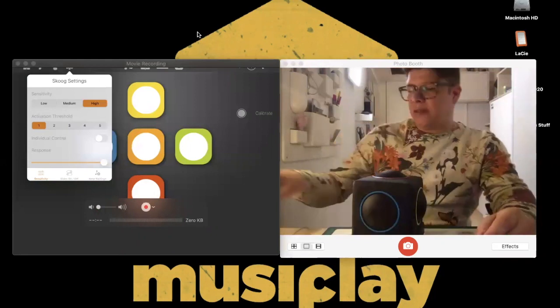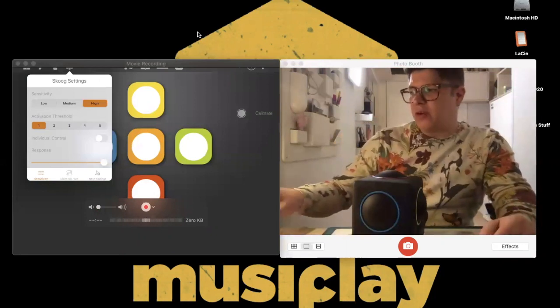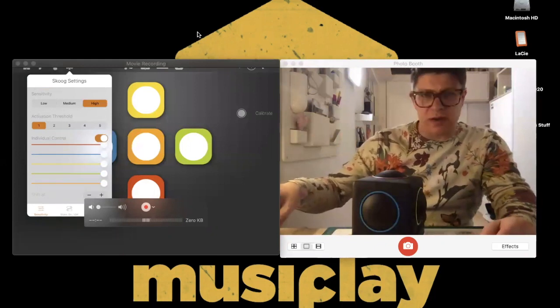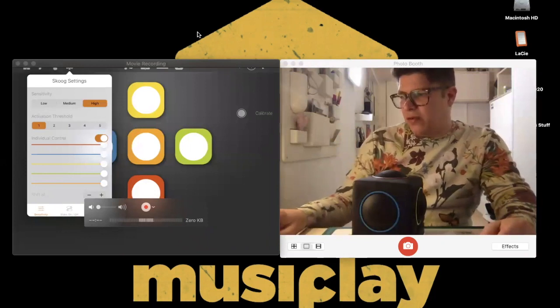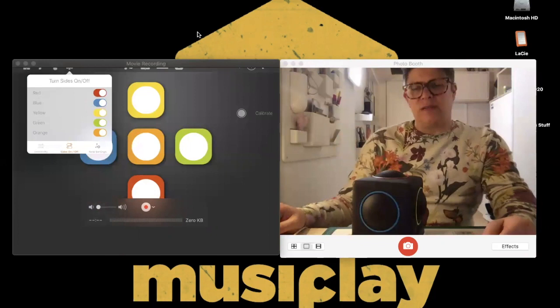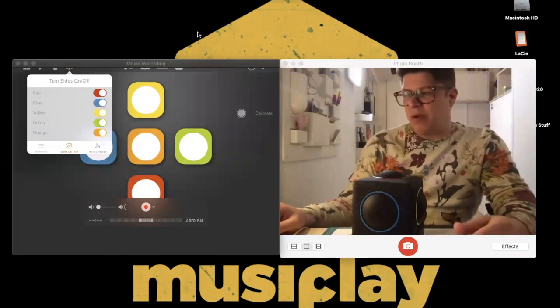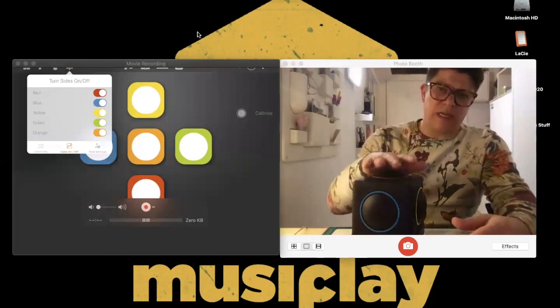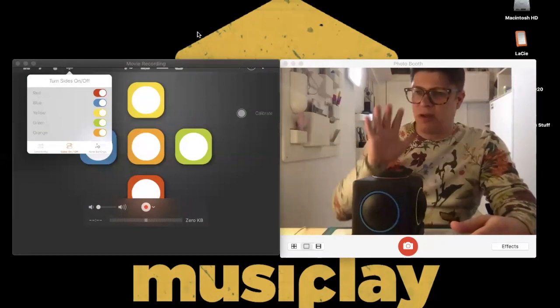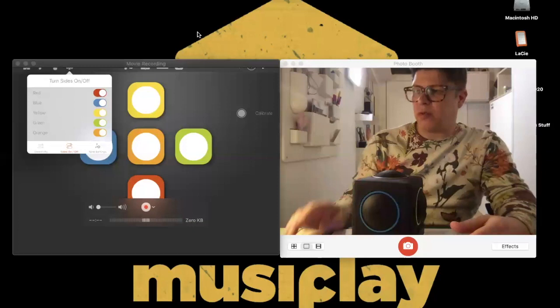So this is where you set the sensitivity settings. You can also adjust the response of each side individually with a slider, if you want to customize that. Another thing you can do is turn sides on or off. For some class activities, but also for some individuals, you might want to focus them on one particular activity. We've seen that in neuro rehab contexts in terms of trying to reach and press at least one side.